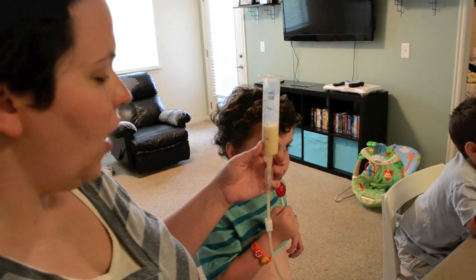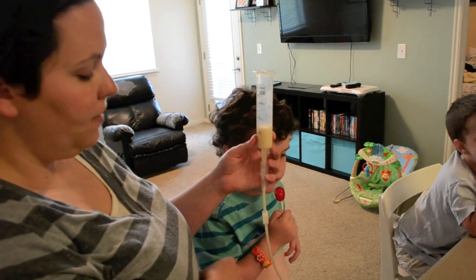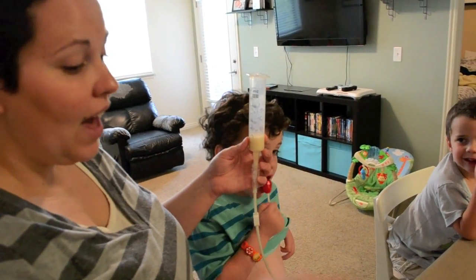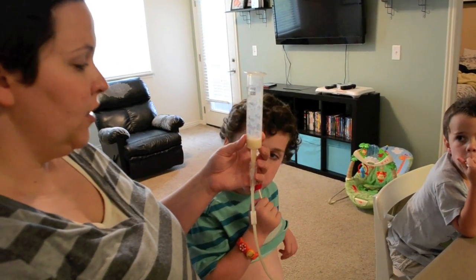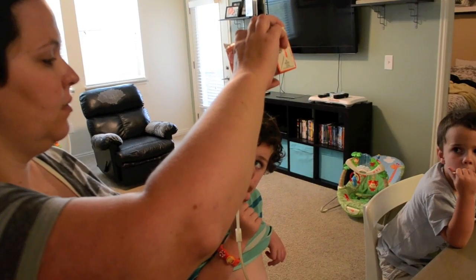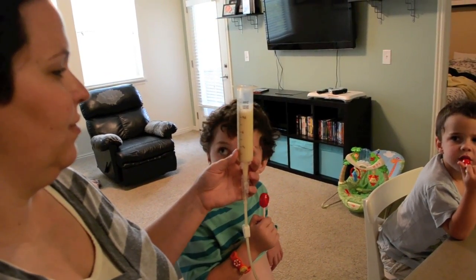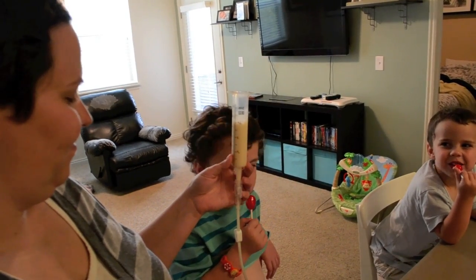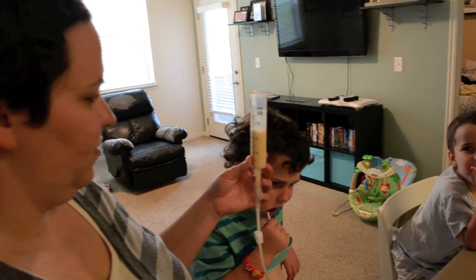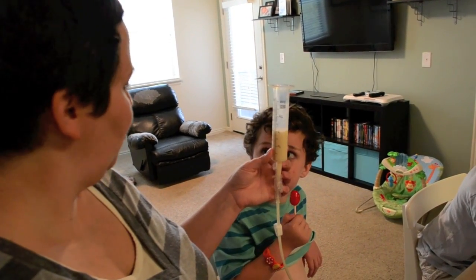If you're finding that it's not flowing, check the clamp to make sure it's open, and make sure you took off the catheter tip on the syringe — those are the most common problems. Kyle doesn't find any of this uncomfortable or unusual.